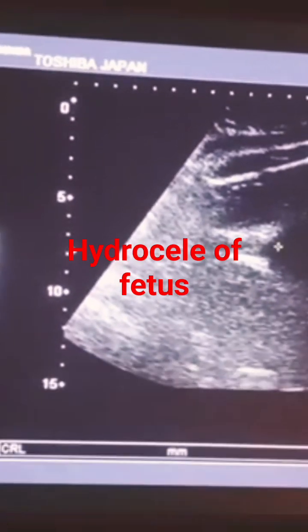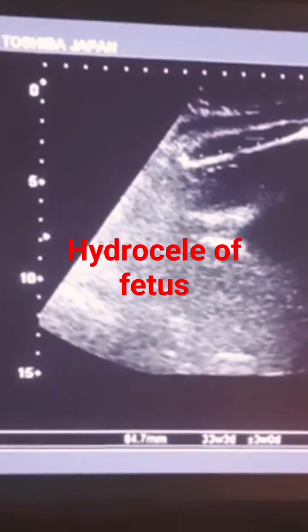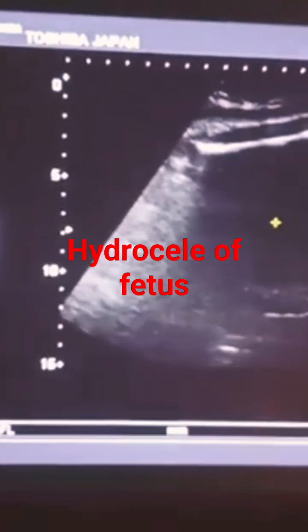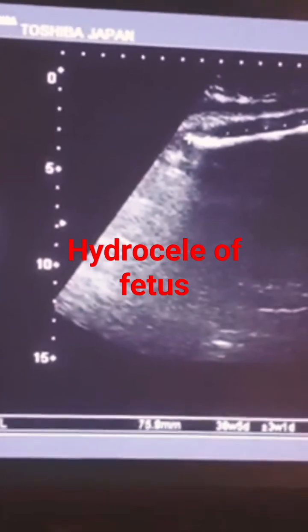Now, this is the femur length. You can appreciate the femur length. Femur length is also at 37 or 38 plus.